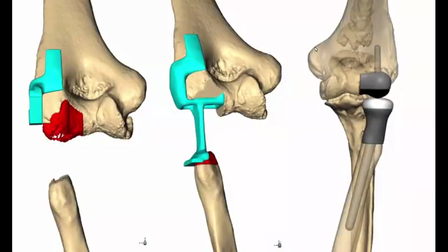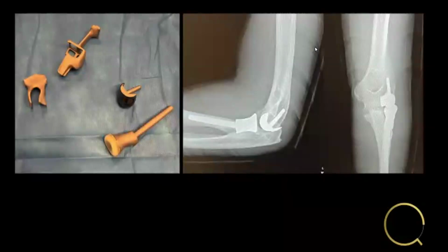This was a patient where radial head resection had failed. So he had a prosthesis, it was removed, a lot of bone loss, severe pain, severe stiffness, and some instability. And because of the bone loss, we didn't have a system that we could actually use. So we decided, of course, by talking to the patient, to print one of these prostheses. And we used a Belgian company to do this, because they were the only ones that we knew of that could marry the polyethylene of the articulation to the printed implant. We used guides. This is not the topic of this talk, so we'll go over this very quickly. We used guides, and we cemented the implant in place.